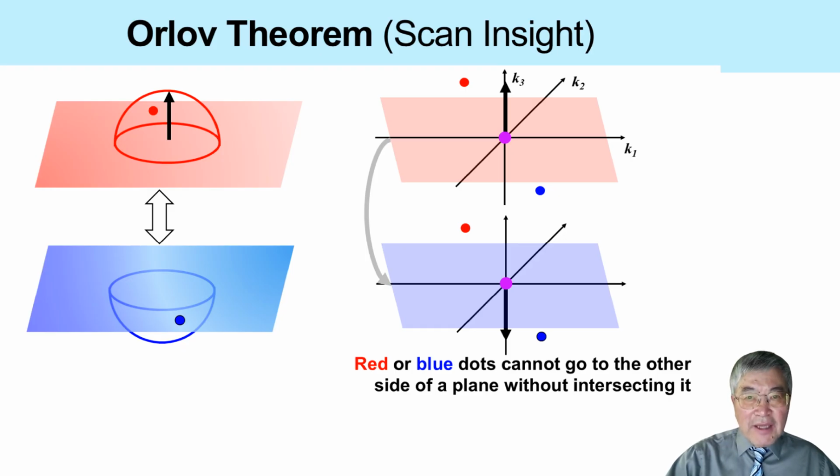If the normal vector of the projection plane is inverted continuously, then the collected projection data are sufficient, at least in the parallel beam setting, for exact reconstruction by inverse Fourier transform. So the Orlov theorem gives us a powerful scan condition. It tells us when a three-dimensional parallel beam scan contains enough information for exact reconstruction.